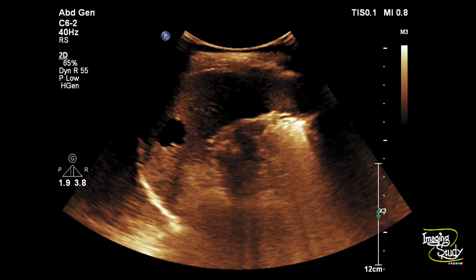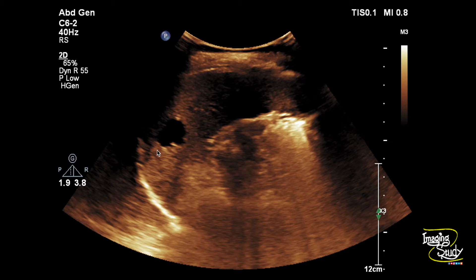Here's a still picture. You can see the cystic lesion. Note that this type of fine irregularity is quite common. But if you see any thickening or surrounding hypoechoic ring, you should definitely look for the infective variety, among which the hydatid cyst is the commonest.